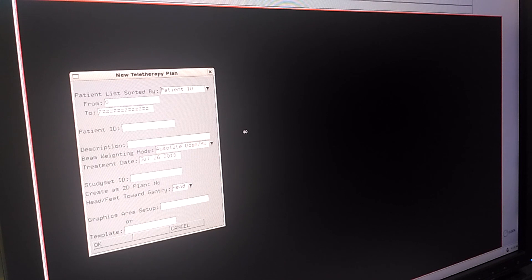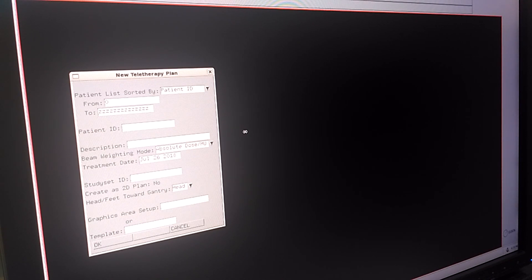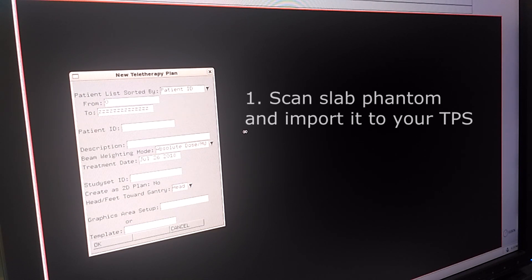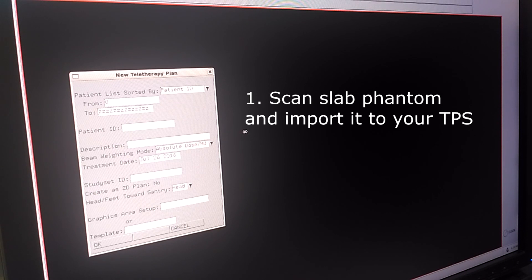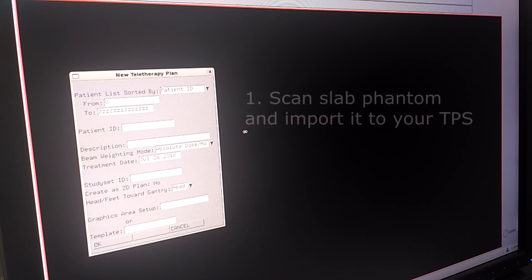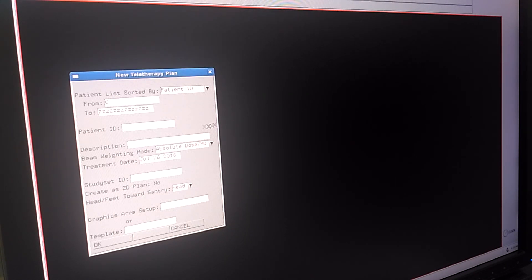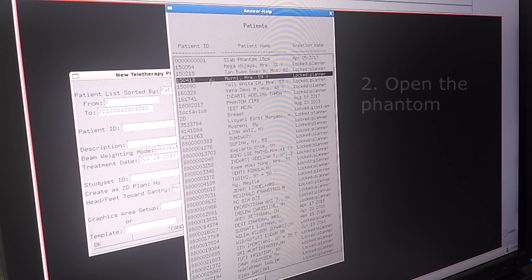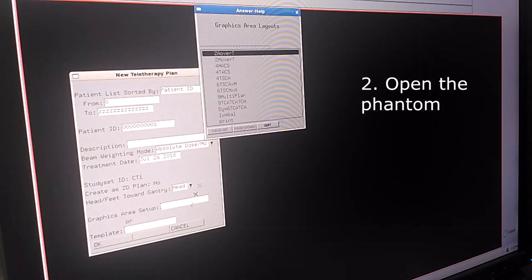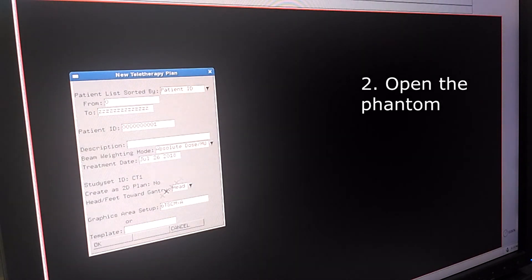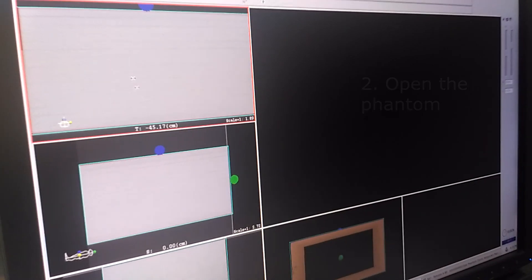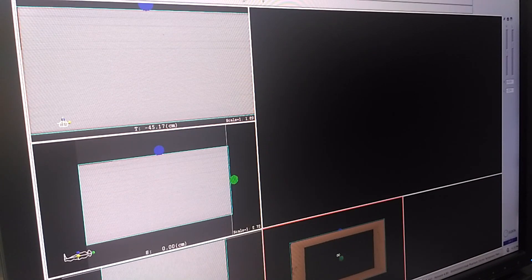Hello everyone, in this last part of video I'm going to show you how to calculate a 2D electron planning using a TPS. The first thing you need to do is you need to scan a slab phantom, import it into your delineation program and then import it to your TPS. And then we are going to open it. I'm going to open the slab phantom which I already scanned. As you can see, this is only a slab phantom.